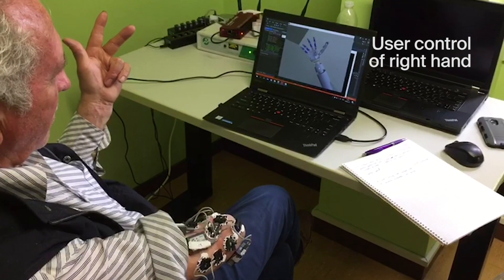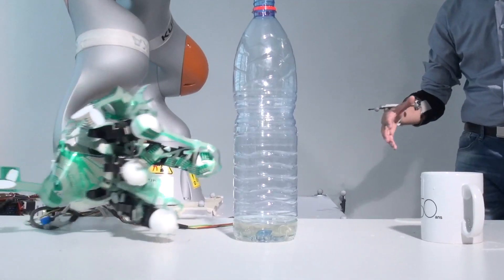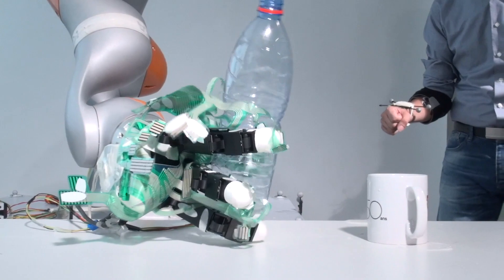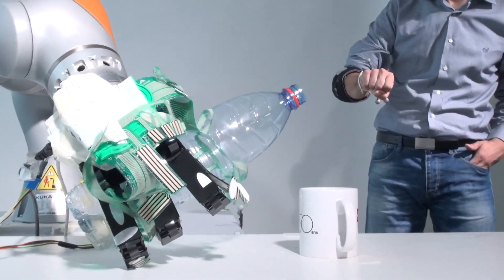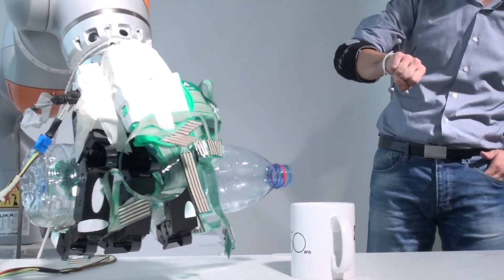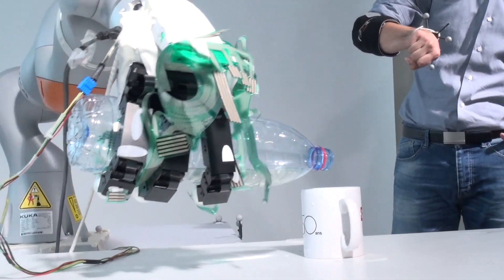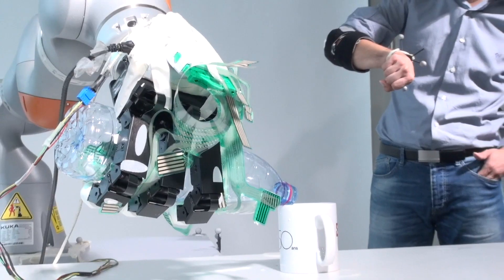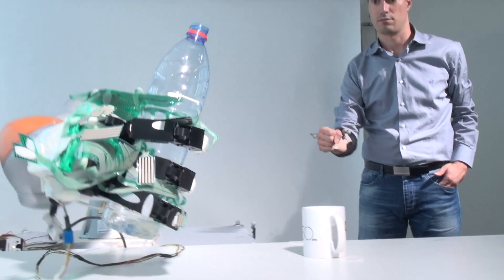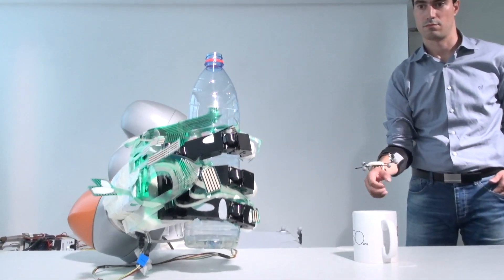On top of that, because predictions of finger movements may not be 100% accurate, we have robotic automation which allows the hand to automatically start closing around an object once contact is made. If the user wants to release an object, all they have to do is try to open their hand and the robotic controller turns off, returning all control back to the user.